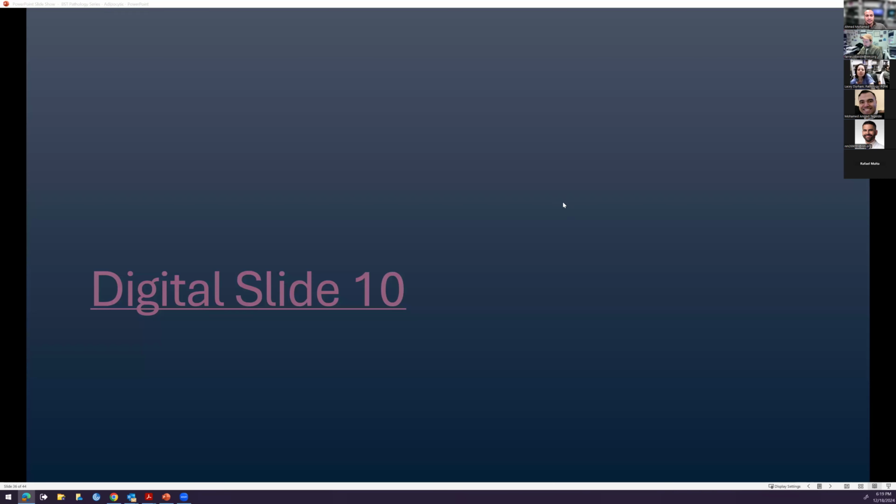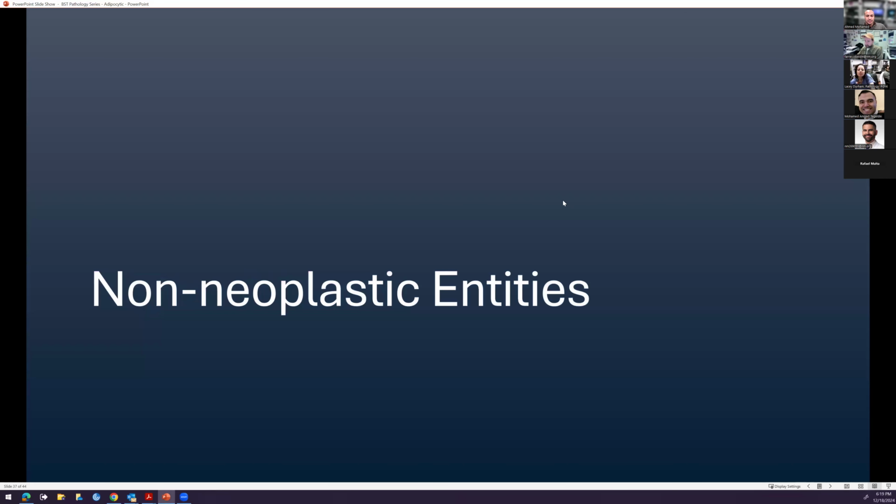All right, and then I think we are almost done. Okay, so I had a couple of non-neoplastic entities. Sorry, we've gone a few minutes over. But a few last-minute things to talk about, because these are the bane of all of our existence as residents. They're going to confuse everybody at one point in your career, so just know them and have these in your head. I just have pictures, I'm not going to have a bunch of slides.